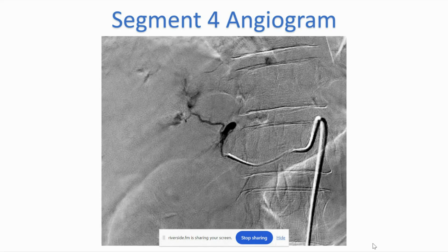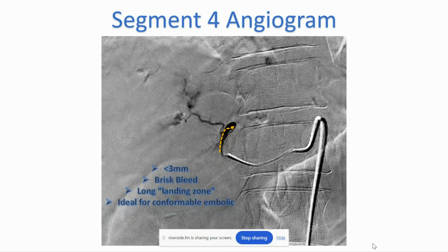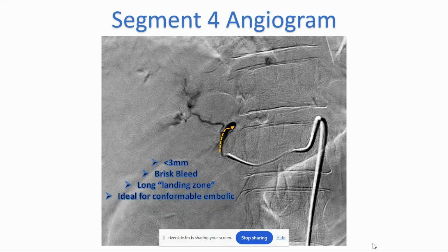And you can see here, again zoomed up, this is the angiogram that delineates where that bleed is. And this is what I was talking about — having a nice runway. You can see here. There's a nice long landing zone, as delineated by that orange dashed arrow.